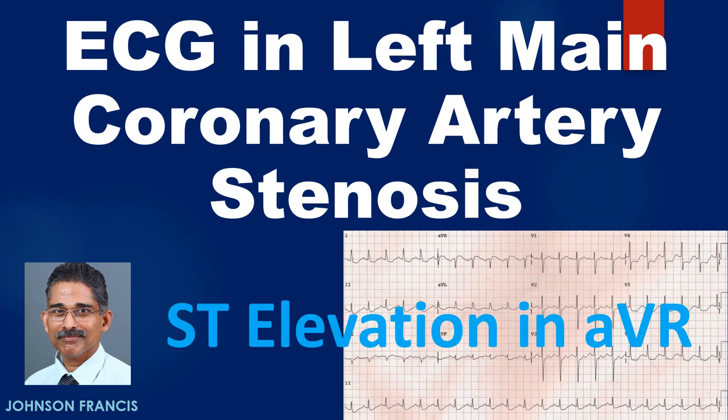Discussion on ECG in left main coronary artery stenosis. The importance of ST elevation in AVR is highlighted.